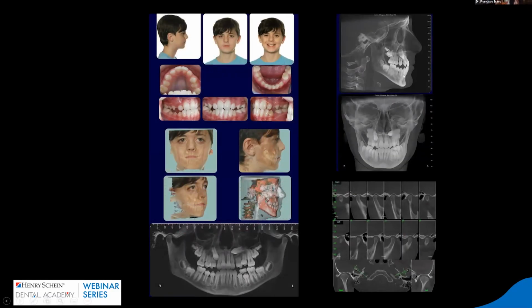So when I say squeezing all of the information, we orthodontists are used to spending time doing diagnosis and treatment plan. And for my records, I use different softwares, by the way, and sometimes I send the information to be read to produce something called an imaging portfolio. The imaging portfolio is no more than segmenting all the anatomical structures in different views.